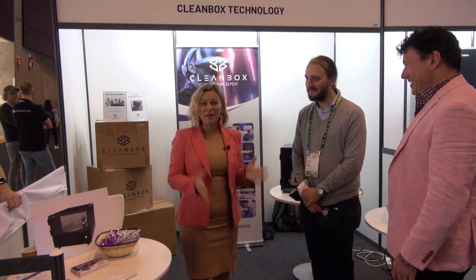Amy, how does it work? We have patented UVC engineering where we use UVC LEDs.